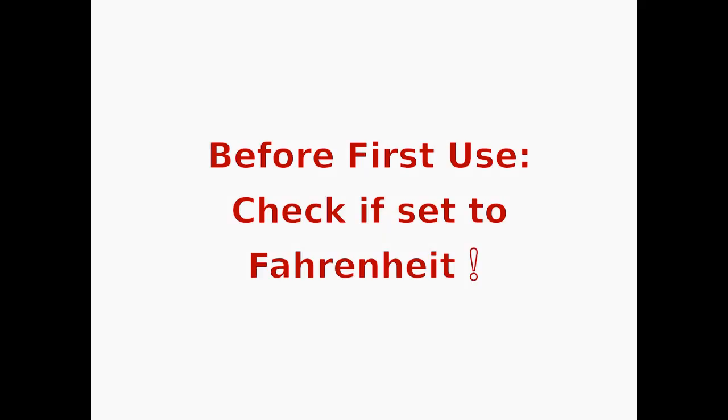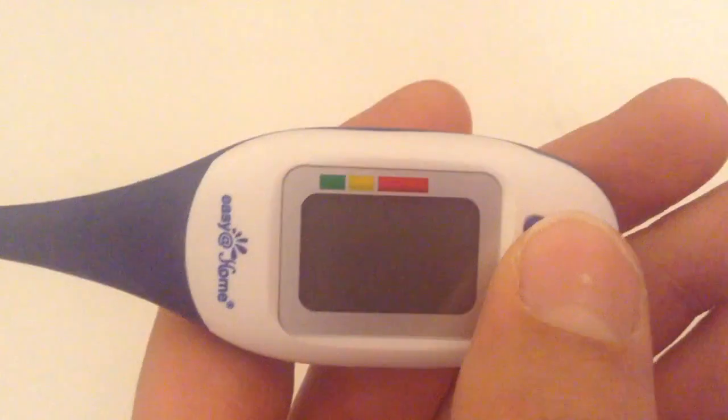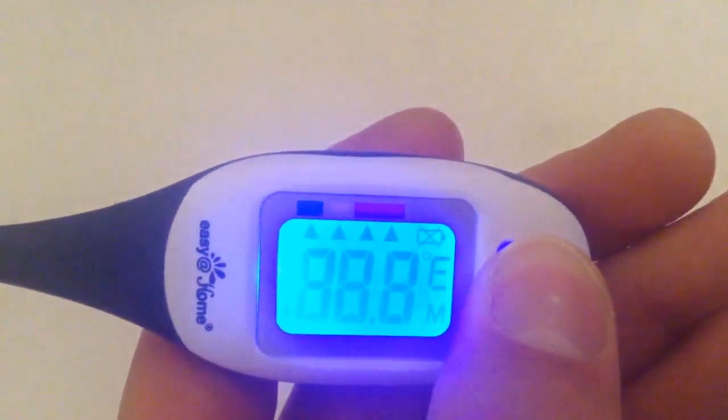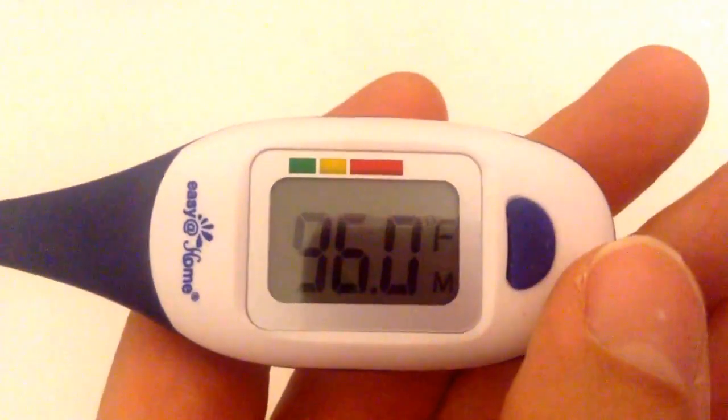Before first use, I recommend checking if it is set to Fahrenheit. Mine was, but in case yours is not, it's simple to switch from Celsius to Fahrenheit. While the thermometer is off, press and hold the blue on-off button for around 3 seconds and you're done. You will see an F in the right corner of the display and it's ready to use. Simply repeat the procedure if you want to switch back to Celsius.